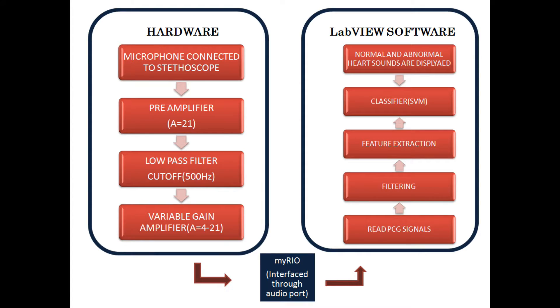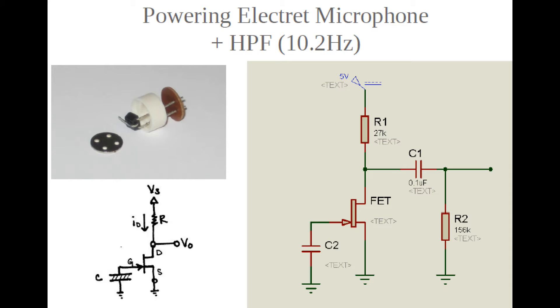These signals are the sequence of heart sounds S1 and S2. In the hardware setup, the electret condenser microphone acts as a sensor.